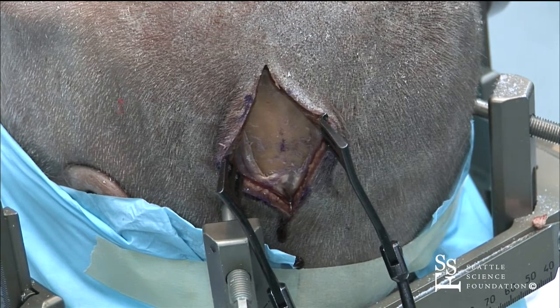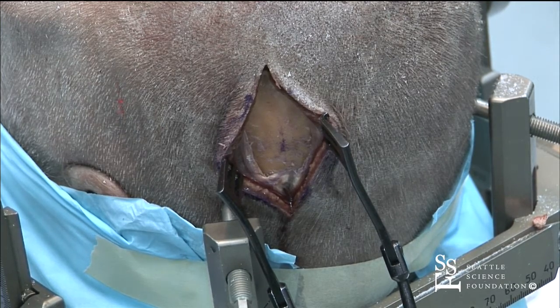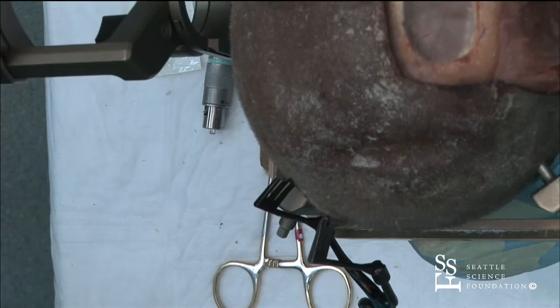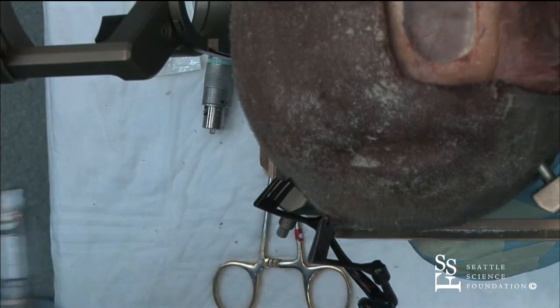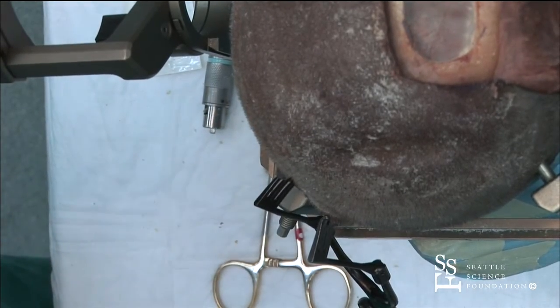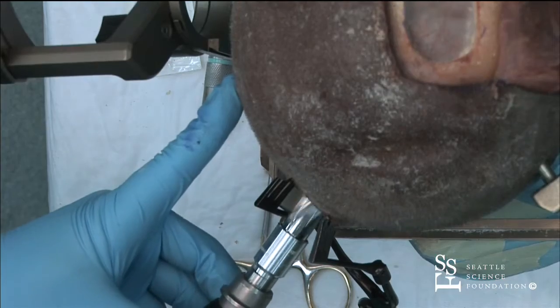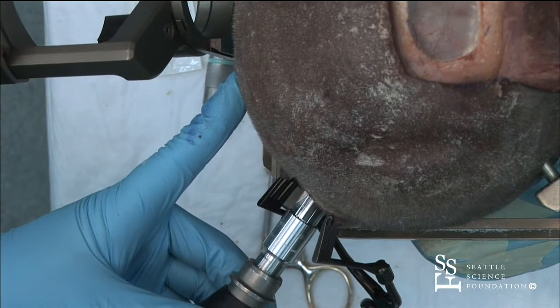Pull straight out. Pull straight out. Here, I'll let you do it. Nice. All right. Well. So again, usually after I open up the skin, I'll come back and make sure that my trajectory lines up so that my burr hole is going to be in the right spot.